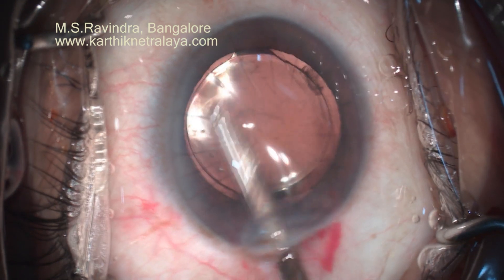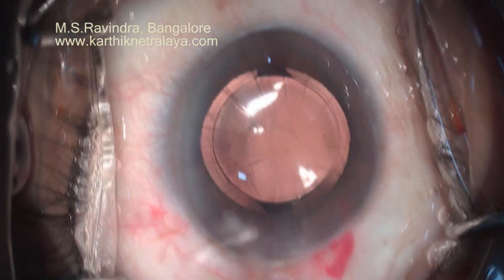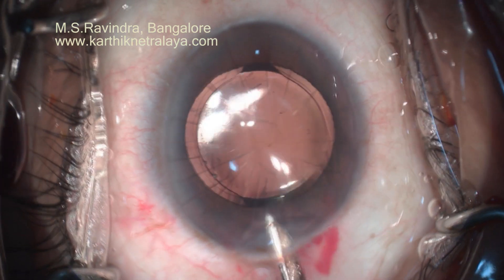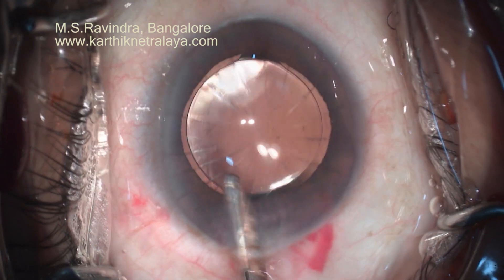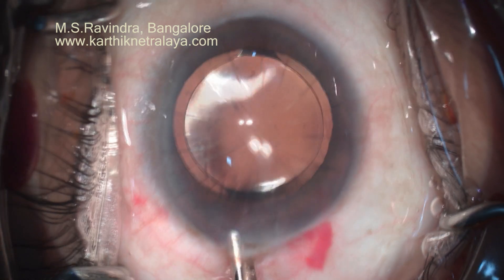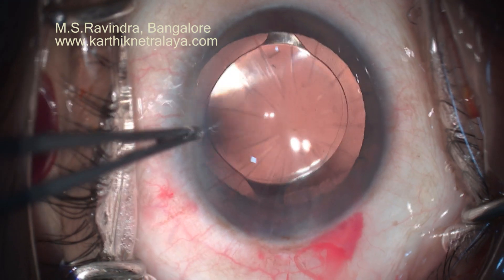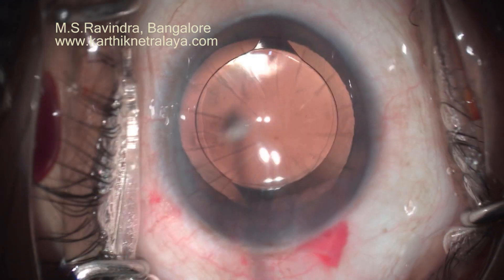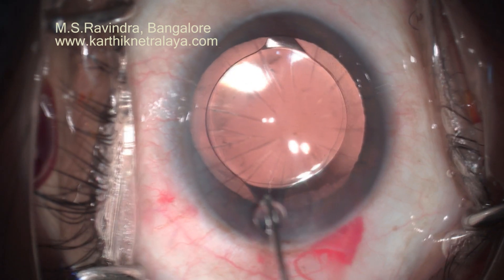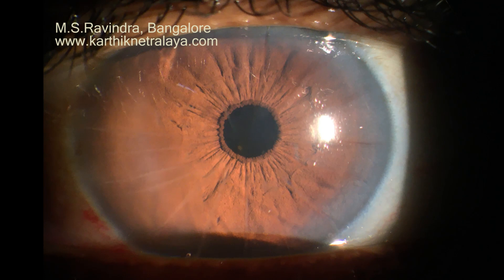That's the end of surgery. There's no need to hydrate the tunnel and no opening of the RK incisions. The patient had excellent post-operative recovery; there's no need to bandage this eye. As you can see, there are more than 24 irregularly shaped RK incisions. This is the first post-operative day — the cornea looks very good, only the tunnel area has a certain amount of edema, and the rest of the cornea is absolutely clear.